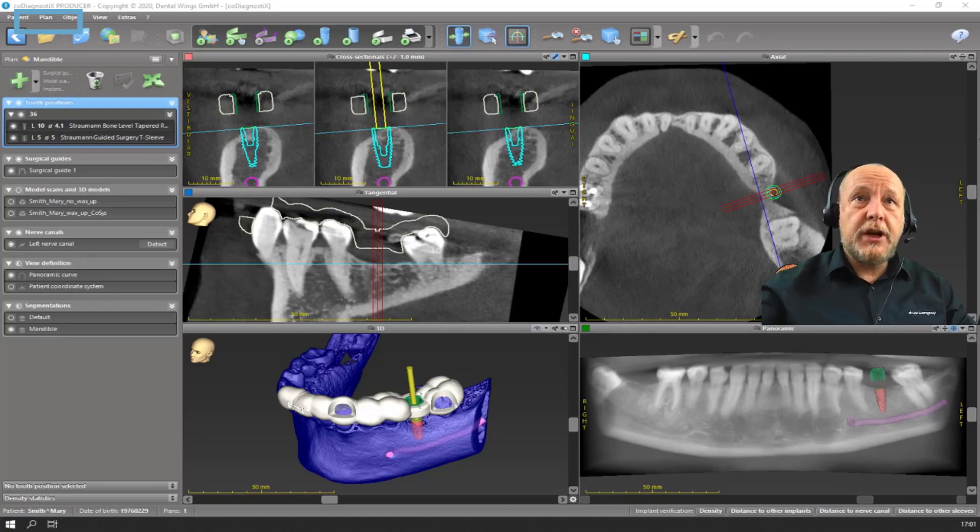And for this it's easy. Just go on Plan, Lock Implants, and you see a locker on the right side of your implant. It cannot be changed anymore. But the lab can design the surgical guide and move the sleeve.